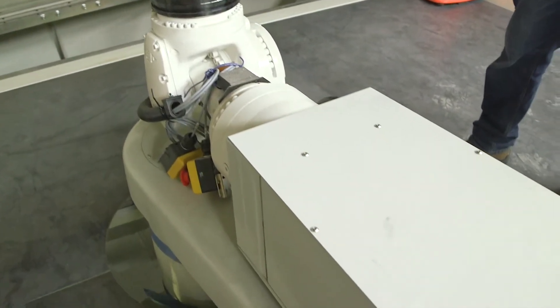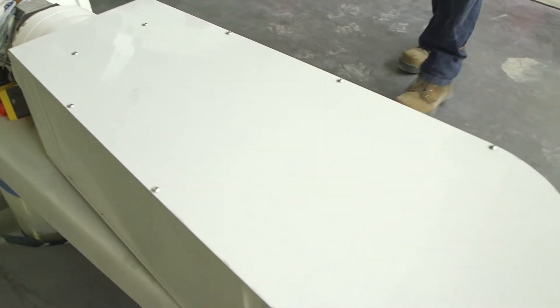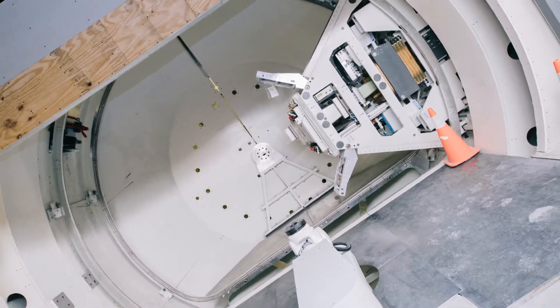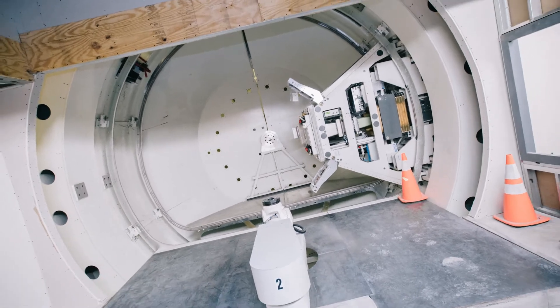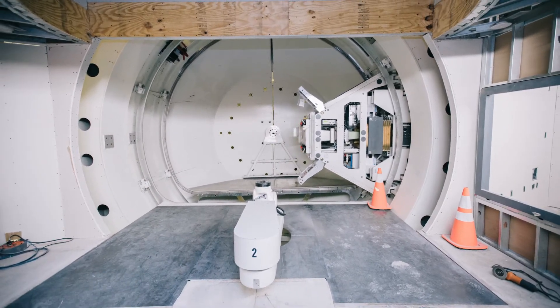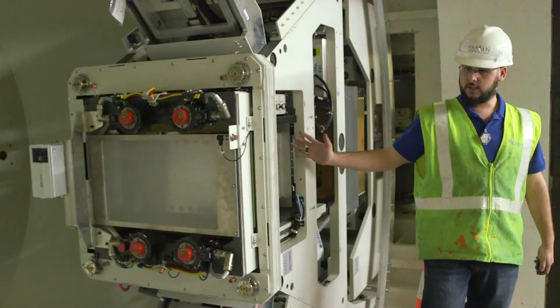A robotic patient positioner system is used to precisely align the patient, while the gantry can rotate 360 degrees around the patient to direct the proton beam from the most appropriate angle towards the tumor.